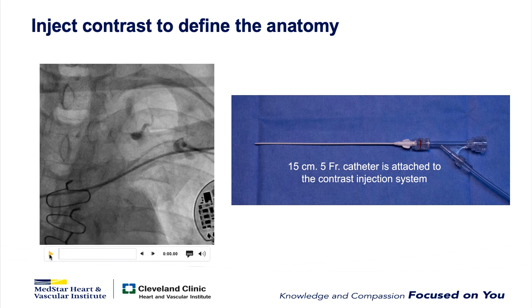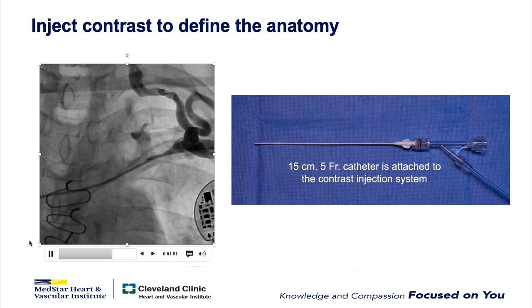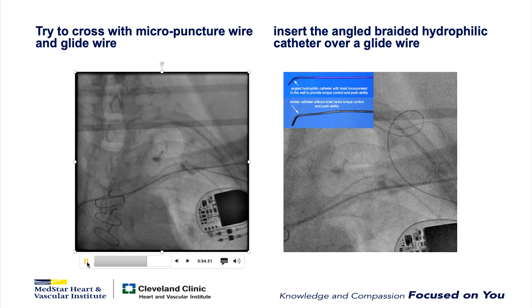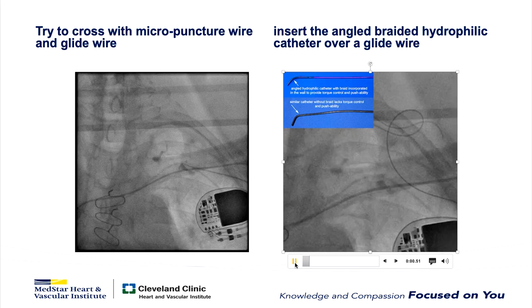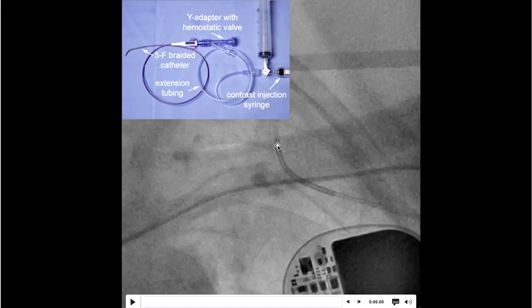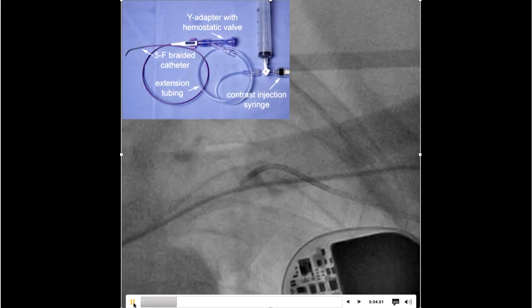The next step is to define the anatomy by injecting contrast, which shows you the area available to cross the occlusion. Wires alone frequently have difficulty crossing occlusions — here we try first a micropuncture wire and then a glide wire and couldn't get across. So we get out our 5 French angled hydrophilic catheter and place it over a glide wire that's been placed up into the collaterals. Once the angled catheter is in, we attach it to the contrast injection system with a rotating hemostatic valve.